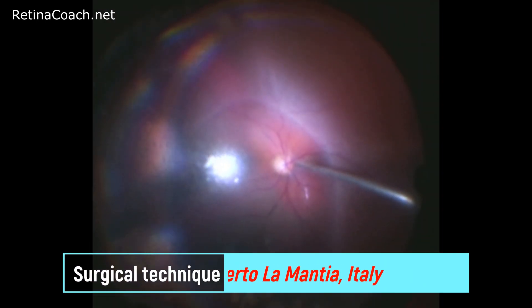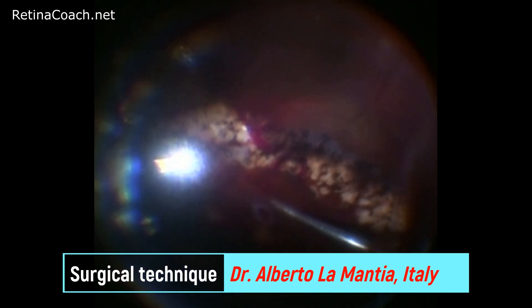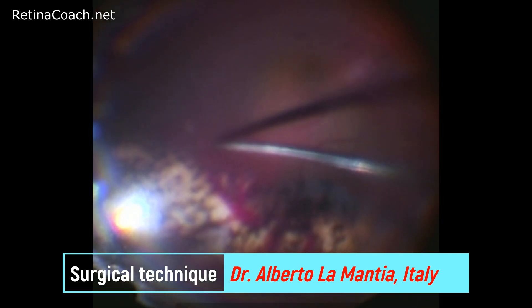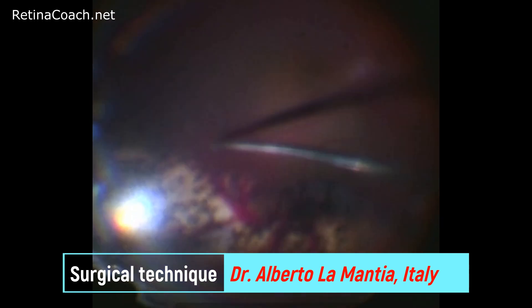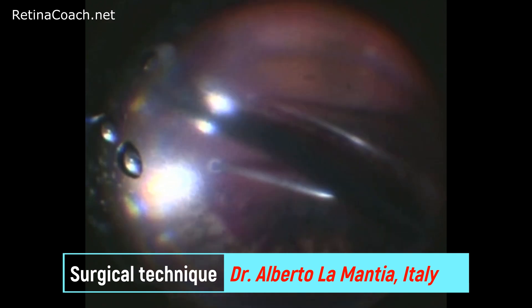Now I want to show you one more case where drainage retinotomy was used. This patient had a recurrent retinal detachment a few years after a prior treatment elsewhere with a scleral buckle and suboptimal laser retinopexy around the retinal break, followed by buckle extrusion and its removal. In this case, perfluorocarbon liquid was injected to drain the fluid through the pre-existing retinal break anteriorly through the laser scars. However, subretinal fluid was trapped, thus drainage retinotomy with diathermy was performed posteriorly to the scars on the same side of the break.